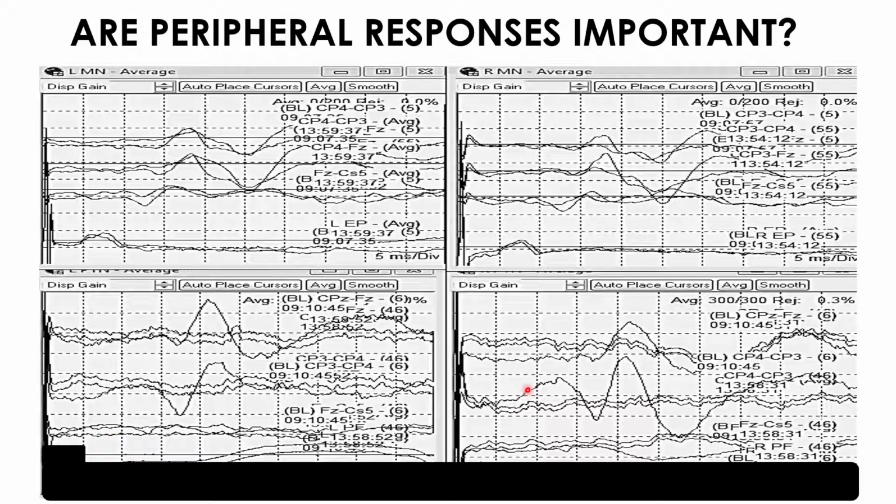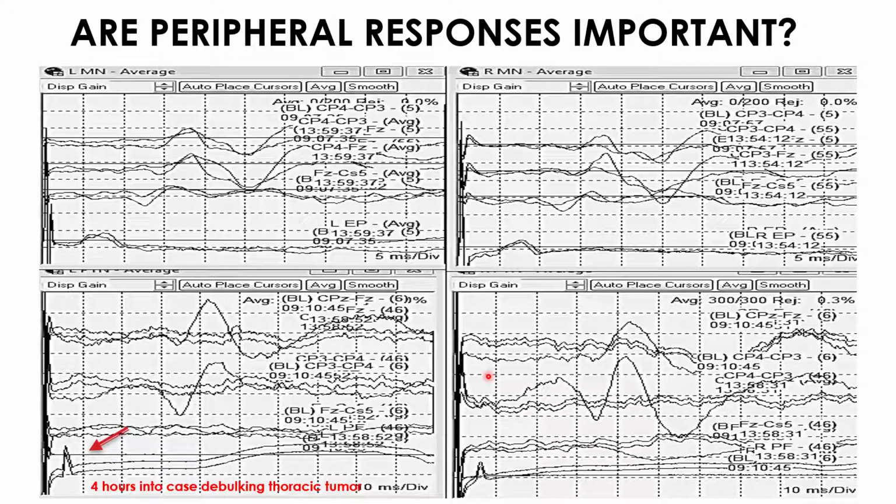If we were not recording that popliteal fossa response for some reason, then you would have to go through a whole series of technical troubleshooting before you could get to the point where it's probably a surgical change, wasting precious time of reporting a change. You can clearly see that there's not a problem technically, because the popliteal fossa response did not change when the rest of the data did change.